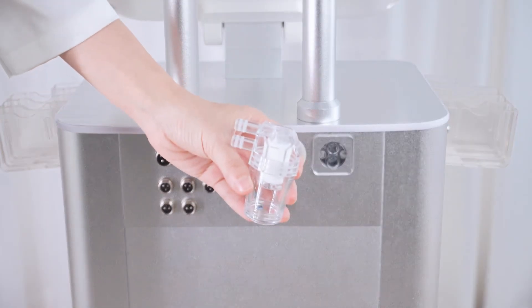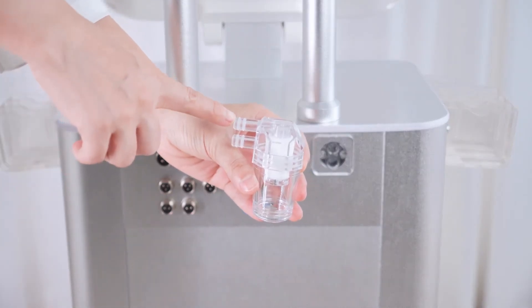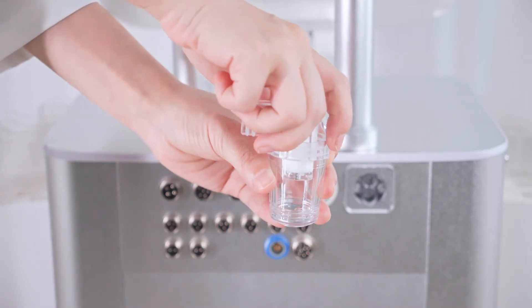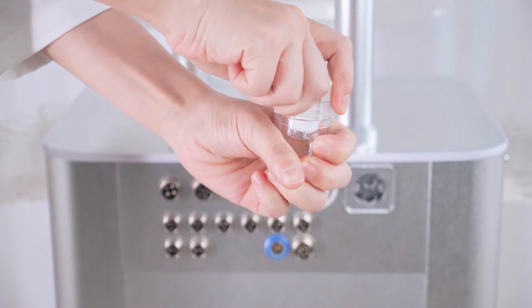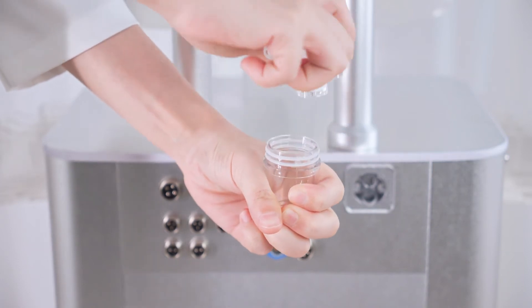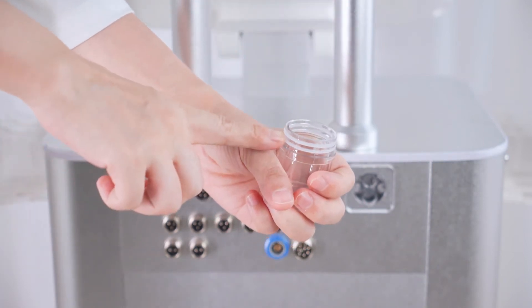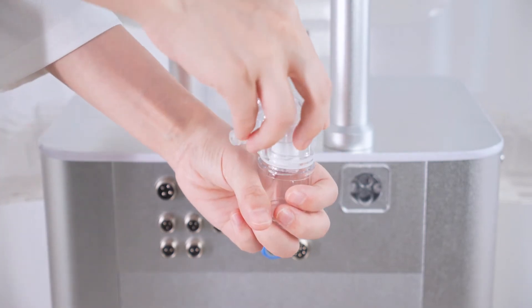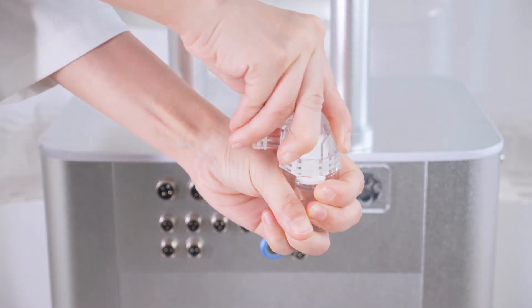There are a big and a small white spare rubber rings in the accessory bag for the device filter. Replace the broken ones if any. Remove the filter and you will see a small rubber ring on it; unscrew the filter and you will see a big rubber ring, which can be replaced.